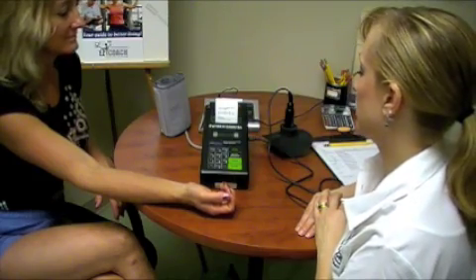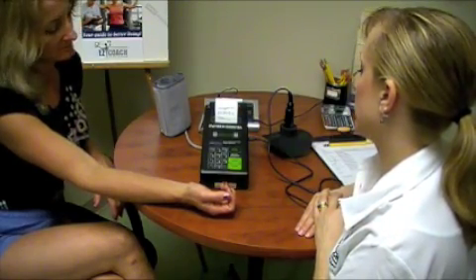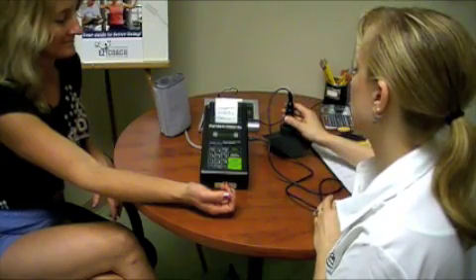Measure percentage of body fat using the Futrex Body Composition Analyzer.